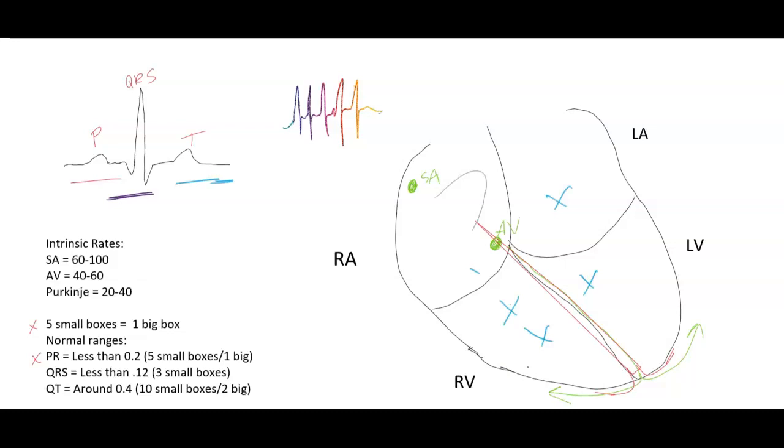This little rainbow rhythm here, this is my very crude drawing of a supraventricular tachycardia. Now with this, we can't really see P waves. It looks pretty regular. AFib tends to be a little bit more irregular, but this is fast. So again, we can't really tell if there's a P wave issue. So we may call it supraventricular tachycardia. It's rapid, and something's happening above the ventricles, supraventricular. And again, we can tell that because we can't really see P waves.